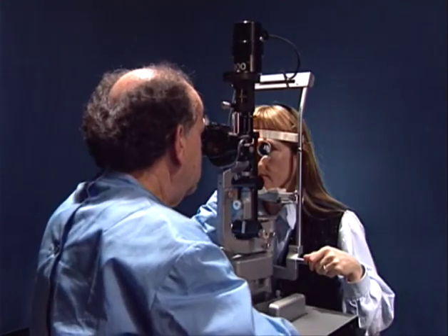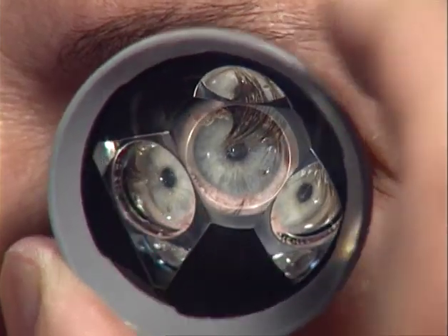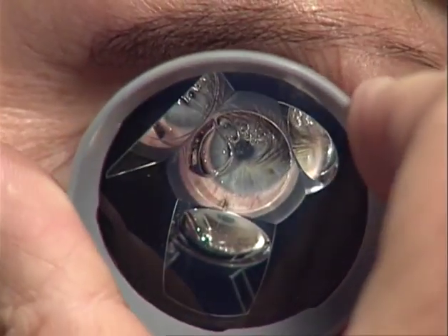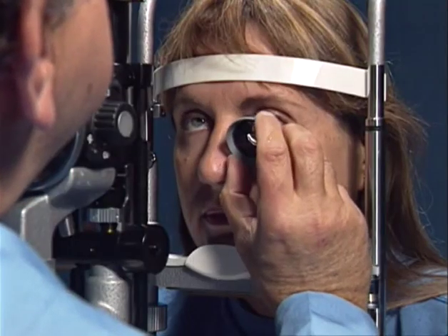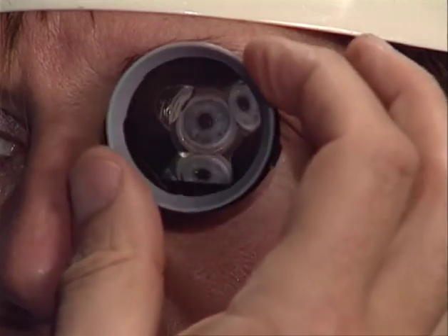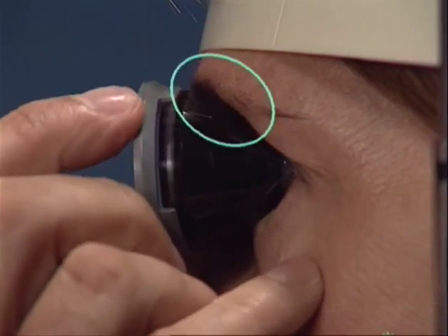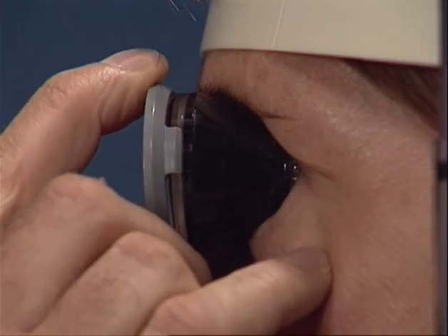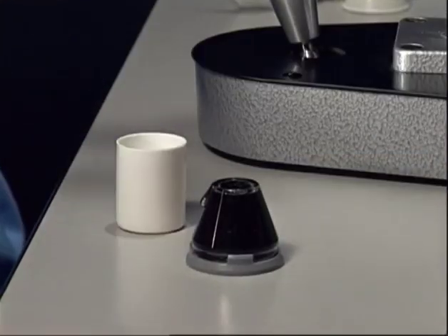Two problems may arise while rotating the contact glass. One is traction on the lid margins and on the cilia, in case they were trapped under the contact glass inadvertently during insertion. This can be prevented by a careful check of the lid margins and cilia, which have to be removed prior to any rotation of the contact glass. The second problem is friction between the cone of the contact glass and the skin of the upper lid. By applying some of the lubricant at the surface of the cone, this friction may be reduced.